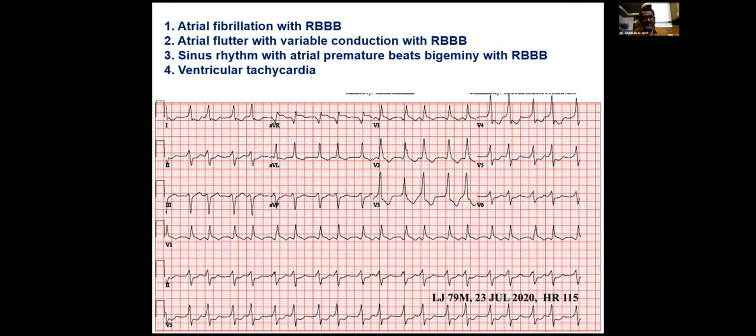Sir, I noticed what Firoz mentioned. I want to go on that point only. To me, it seems it's bigeminal type atrial tachycardia. Yeah, one beat followed by another, and there is a pause. And there is tachycardia, so the pause is a little narrower. So I go for the third choice.